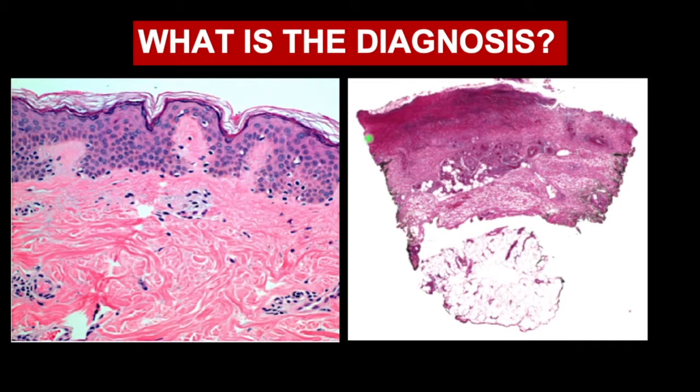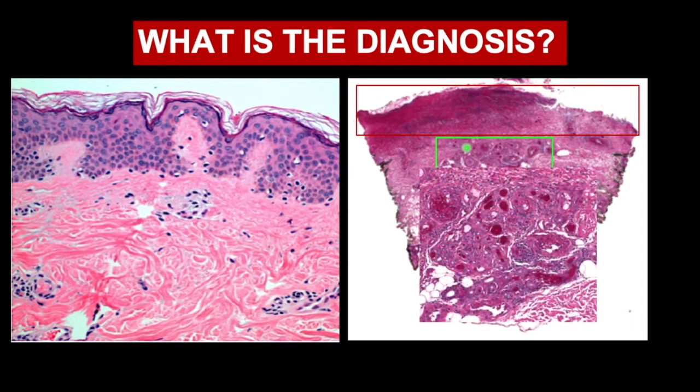In the superficial layer, we see the skin is necrotic, all these areas of dark red. And if you look into this area around the adnexal structure and magnify it, you see the vessel is blocked, and all these small vessels are blocked.